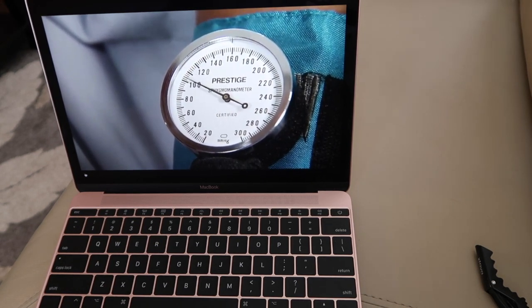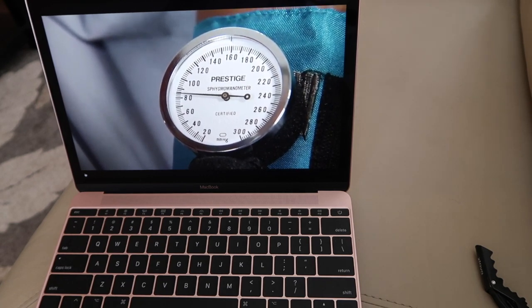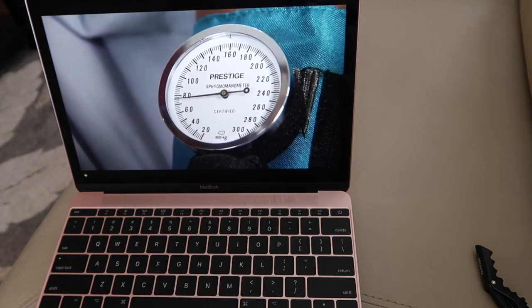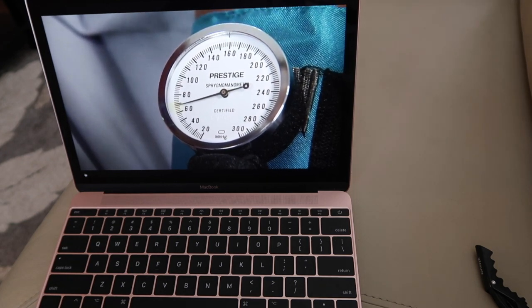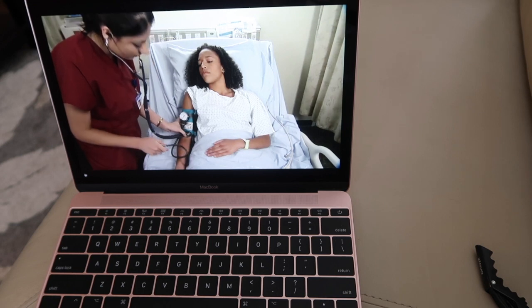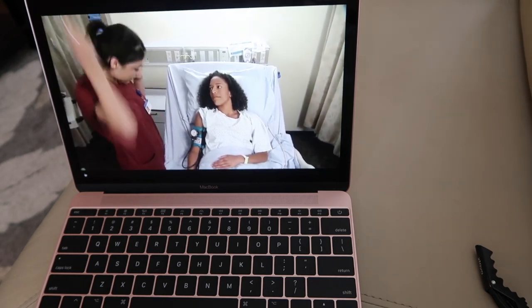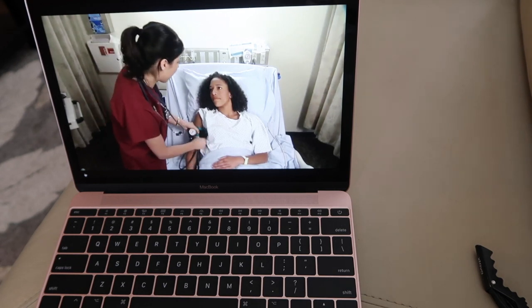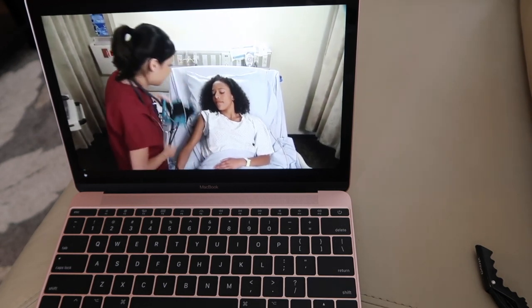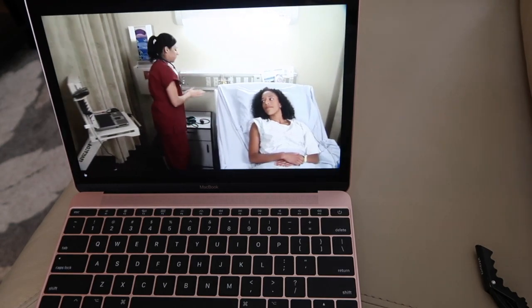Continue to deflate the blood pressure cuff slowly, noting the number at which the sound disappears — this is the patient's diastolic blood pressure. Listen for a few more seconds, then quickly deflate the blood pressure cuff. Remove the blood pressure cuff from the patient's arm and perform hand hygiene. That's how you take a blood pressure.